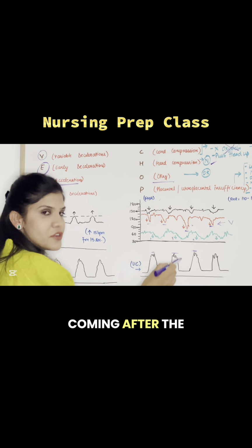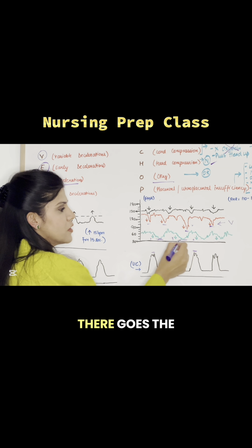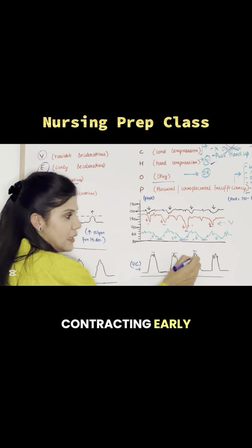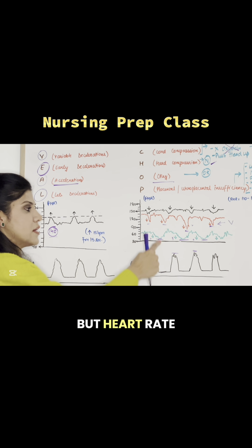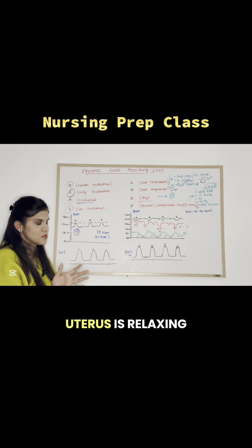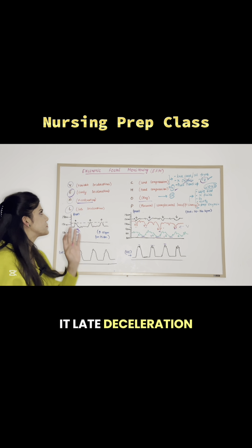So here's the uterine contraction. Here is the dip. Here is the uterine contraction. There goes the dip. So actually, when the uterus was relaxing, the heart rate should not have been dipping, but heart rate is going down after the uterine contraction is over, when the uterus is relaxing. So this is why we call it late deceleration.